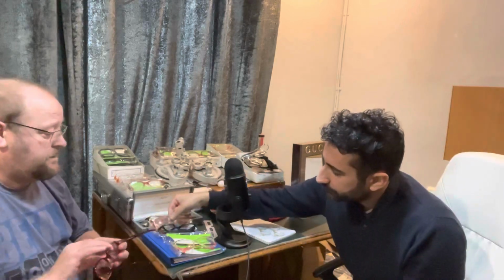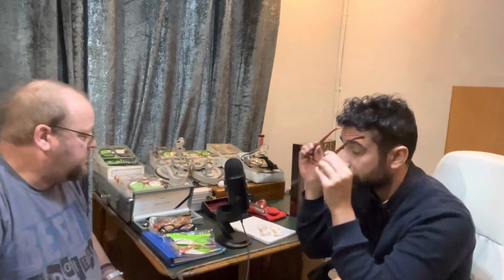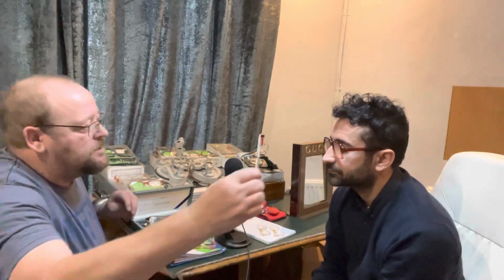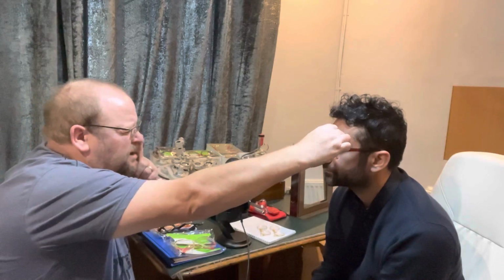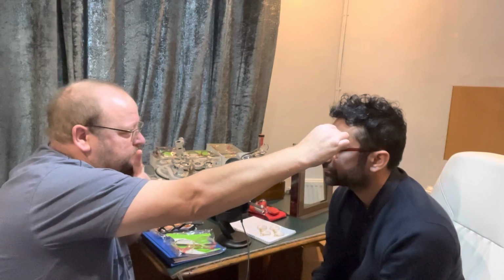Lovely. Could I have the made just for bifocals, please? Yeah, certainly. Can I have these for single vision, distance, green, sun lenses? Yeah, so I'm going to take some measurements then with both of these frames. So if you'd like to put them on for me. So I'm going to measure your pupil distance. So if you look at my finger, then across. Thank you.